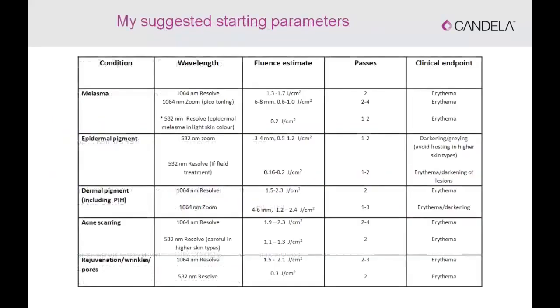I think this is an important slide, and I will leave it on the screen for a few minutes. I want to warn you not to just copy and paste exact parameters, because that depends on the condition you're treating, the skin type, the sensitivity, and also the clinical endpoint. But this is a rough guide of how I approach things when I'm using the PicoWay.